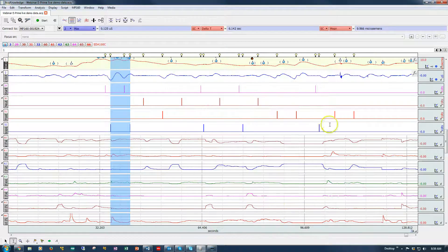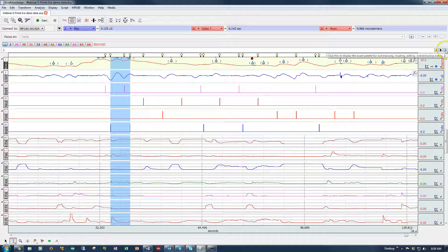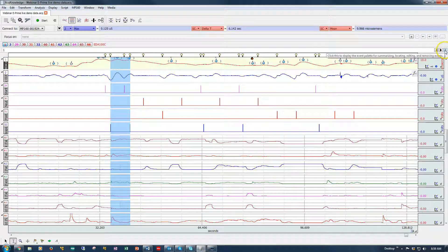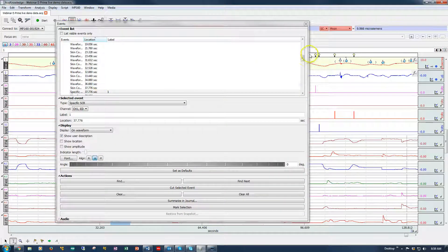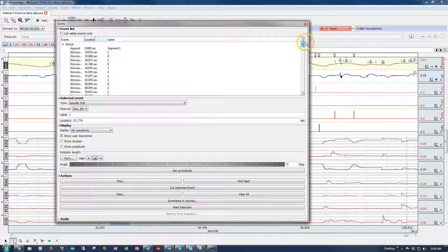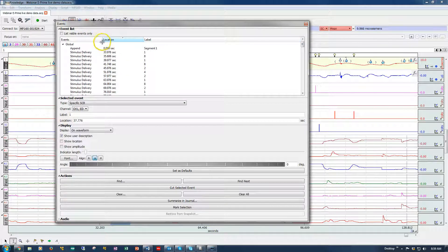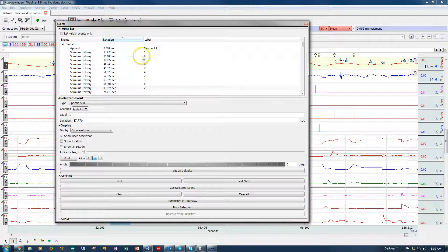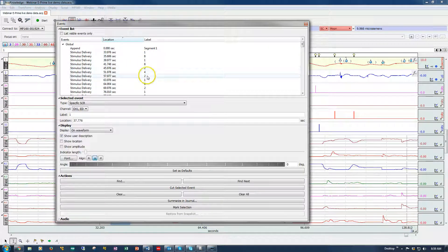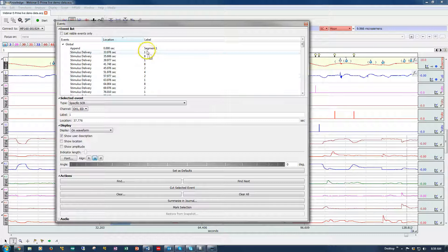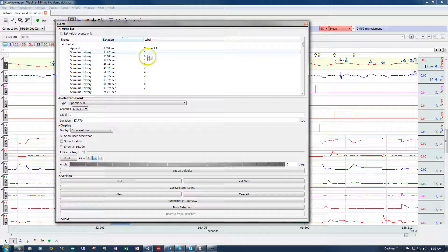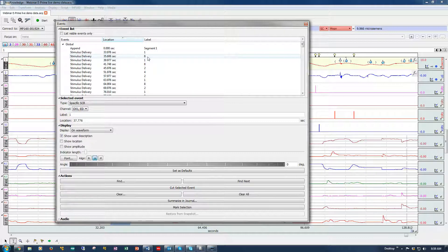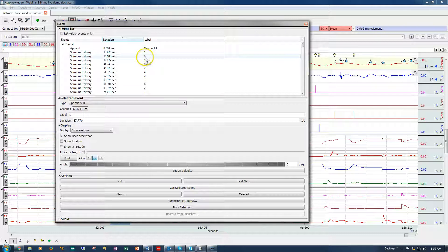I'm going to cancel out. If we come into the event palette, which is this icon on the right hand side, we can see all of the event types. So these were stimulus delivery events with various type numbers. Typically, when the startling image was presented in this example, the participant was supposed to push the button box and respond, and that shows up as a marker type 8. So I'm going to create my focus area between these two specific events.